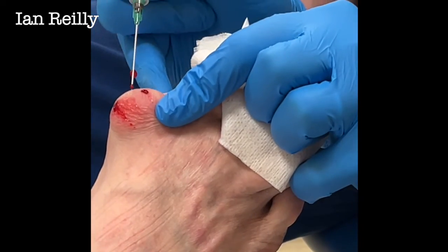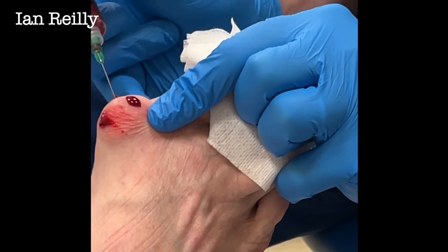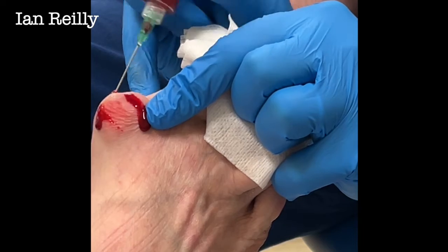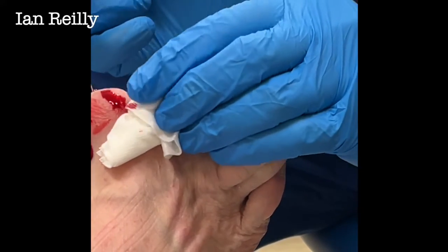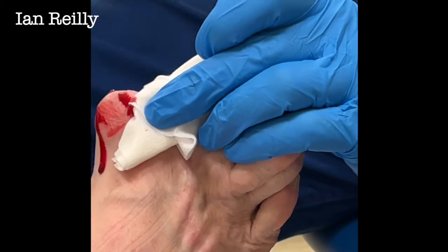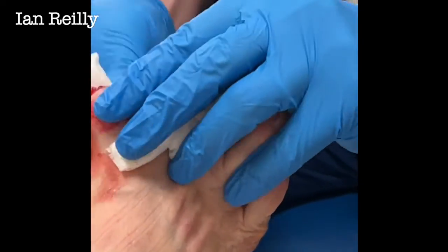What I like to do is just a little bit of peppering of the lesion — that sometimes encourages them just to fall away. Now I'm going to get rid of the needle, go off to one side, and then I'm just going to see if I can get any of the last juice out.